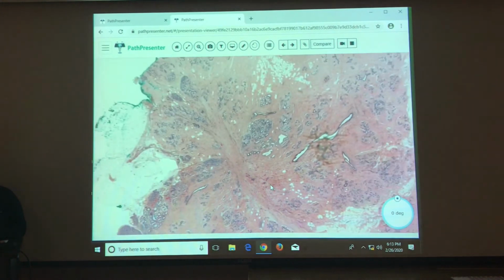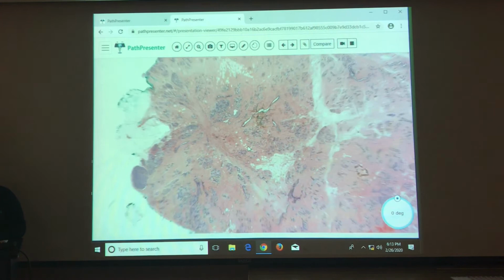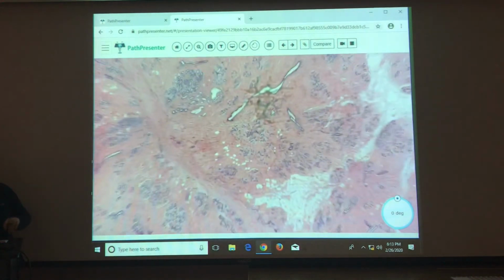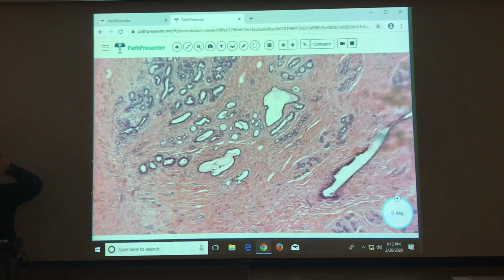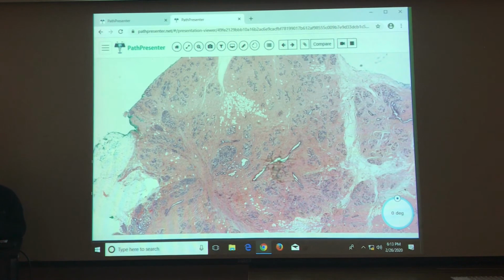Radial scars are not associated with trauma or surgery. It's not the best, but you have a little bit of dilation that's really close to the scar, and it does start to radiate off, and that's what you're looking for: these rays of epithelial components coming off of it. That gives you the star-like appearance, radiating out.